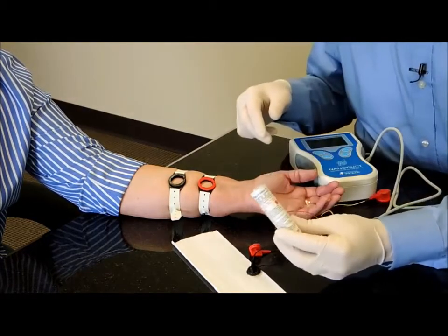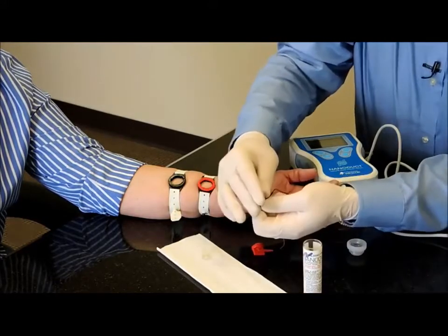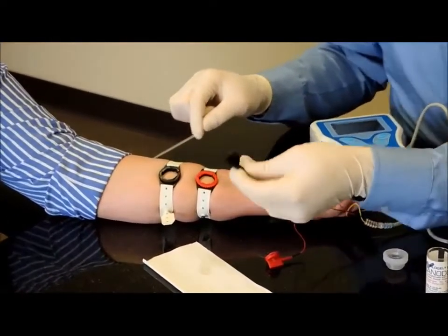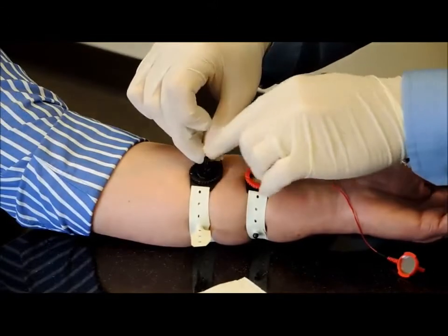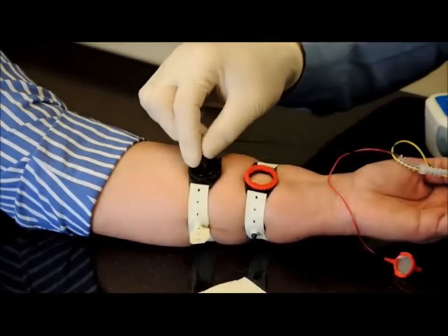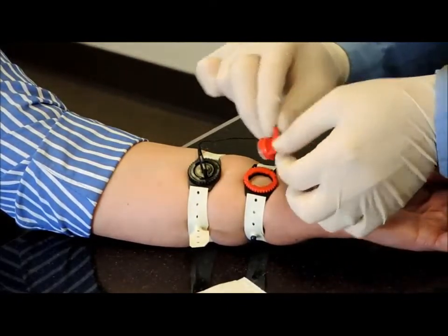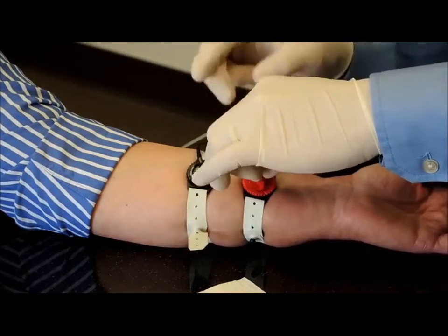So then you take 2 discs out of the vial that I previously described, and 1 disc you'll put into the black electrode. You'll notice the holders of the electrode have little flanges that will mate up with the bottom part of the holder. And so I put in the holder like so and push down, and then I turn the ring about 45 degrees and make sure that that's locked into place. You can get a feel for how that does lock into place with a little bit of practice. I'll put another disc into the red electrode and do the same thing with the red holder. So again, push it down and turn the ring, and so it locks into place.